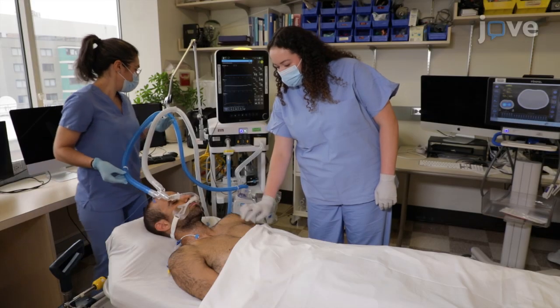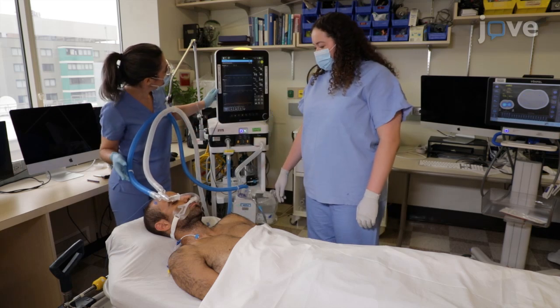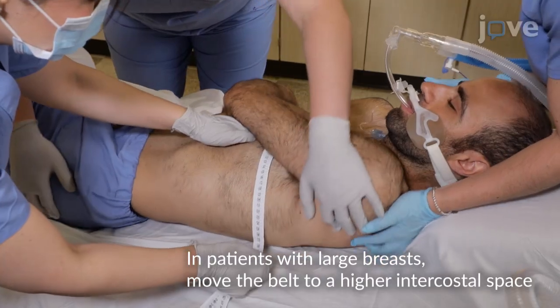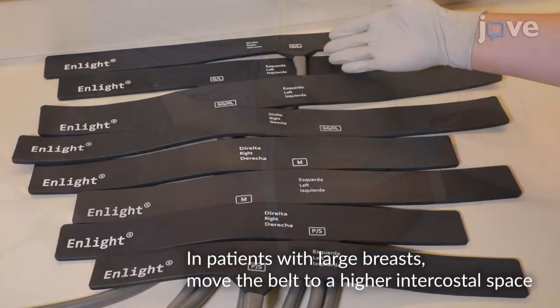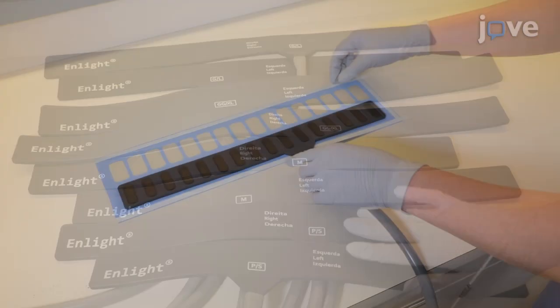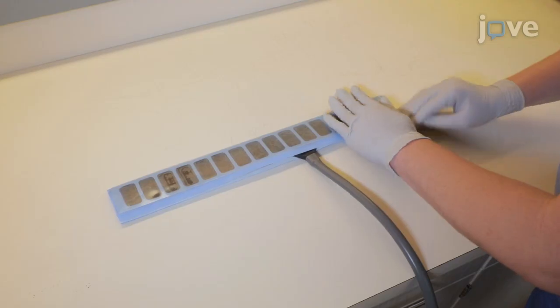To begin, instruct the patient to take the position for chest wall measurement. Using a tape, measure the thoracic perimeter between the fourth and fifth intercostal spaces and choose the appropriate belt among the different sizes.